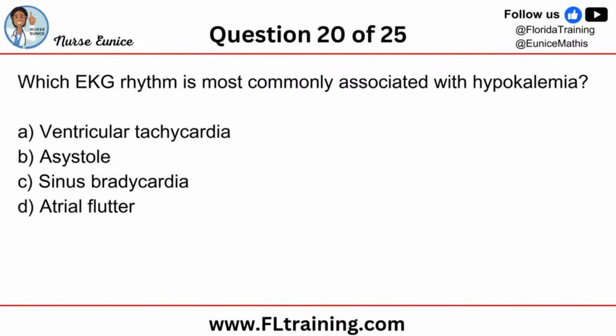And I see you all are giving me answers, but I still want to know what hypokalemia means. Does anyone want to tell me? Ah, got you researching. All right.